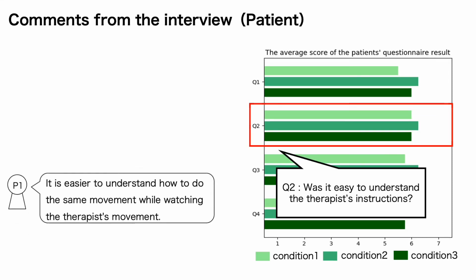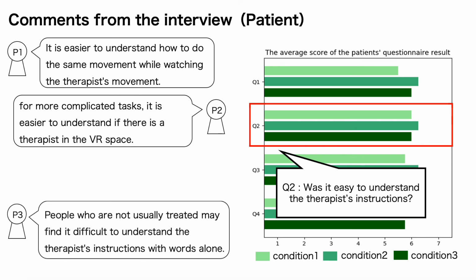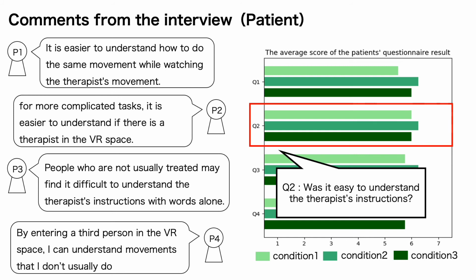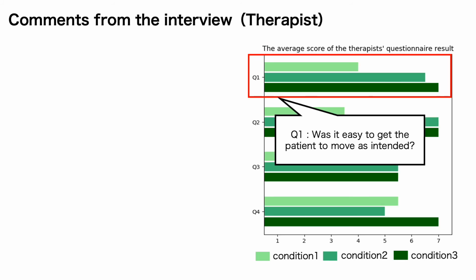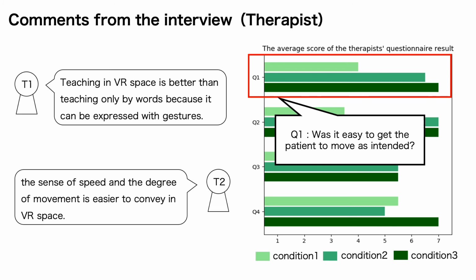From the viewpoint of ease of understanding the therapist's instructions, the following comments were obtained. Many positive opinions have been obtained for the proposed method. From the viewpoint of ease of getting patients to move as intended, the following comments were obtained. Both therapists state that it is easier to give instructions if they are in VR space than only by voice.